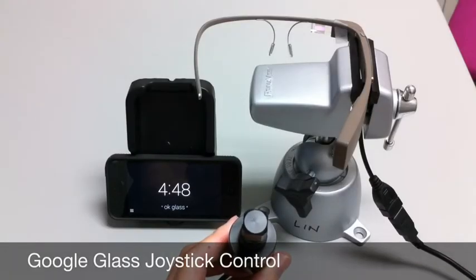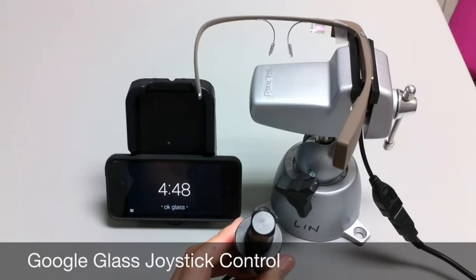Hi, this is Andy Lin, and today I'll be showing you how a joystick that is commonly used with a power wheelchair can also be used with Google Glass. This may be important for someone that doesn't have the manual dexterity to swipe and activate the touchpad on the side of Glass, and thus it might be a viable alternative.